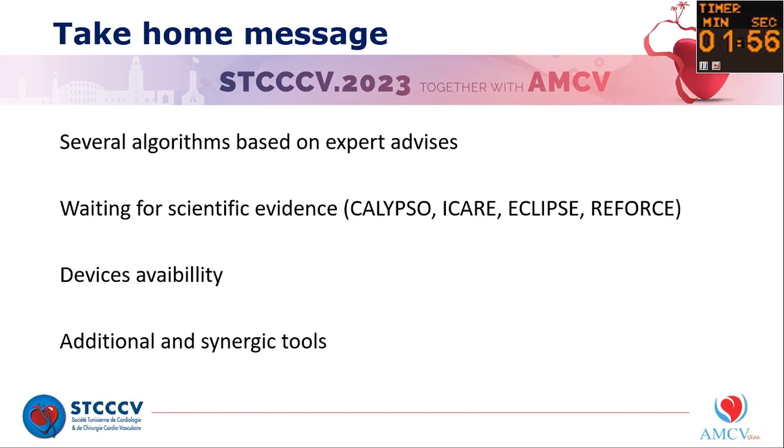Of course, everything that I said depends on the availability of the device. I'm lucky, as I said, and sometimes we use a synergic tool with lithotripsy plus rotablation. Thank you for your attention.